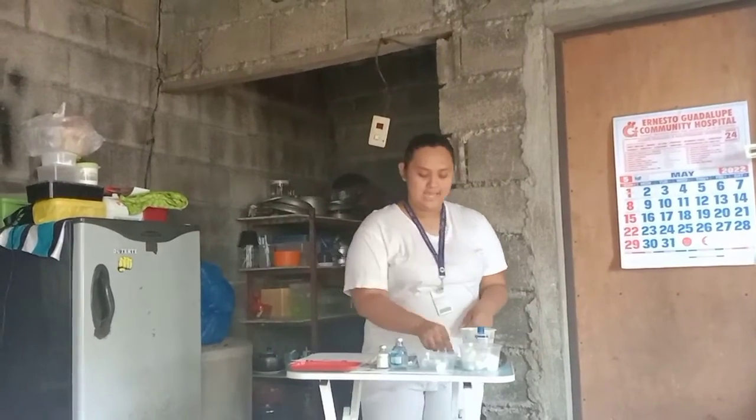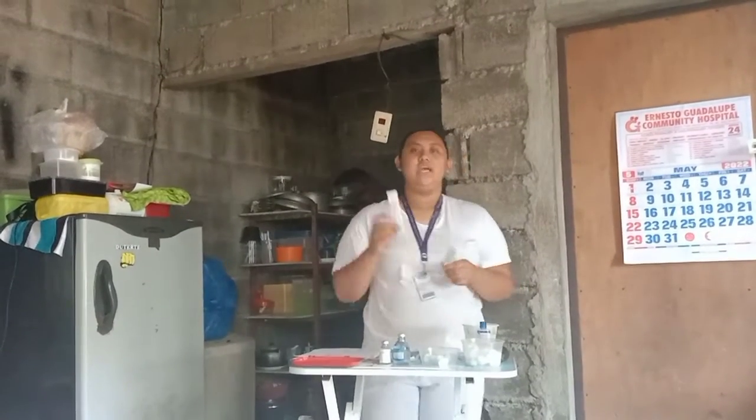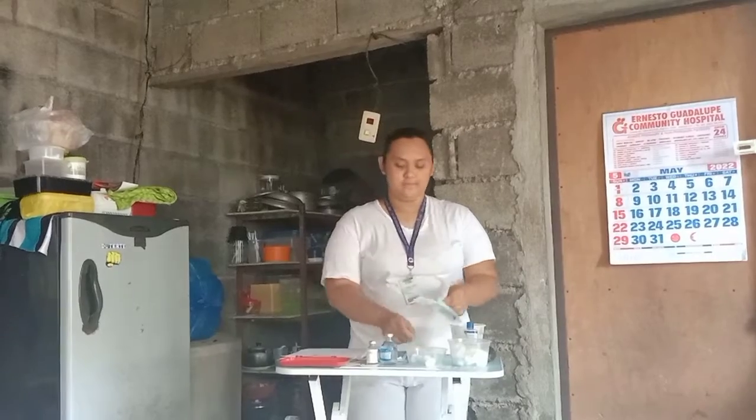Next is to prepare the medication. Of course, we need to have syringes. I have the tuberculin syringe, which is ideal for the skin test for intradermal injections. I also have an insulin syringe for subcutaneous injection and a 23 gauge syringe for intramuscular injections. And the aspirating needle, which I use to draw the medication from the vial, and the sterile water vial and the ampule serve as the medication in this demonstration.